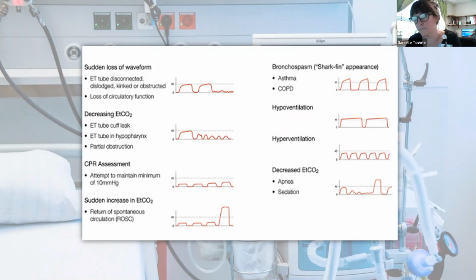So a normal end tidal is about 35 to 45 in a normal, healthy adult. Keep that in mind as I keep talking, okay? Higher than 45 usually indicates that there is retention occurring. And we end up increasing our minute ventilation by either increasing our tidal volume or increasing our respiratory rate, or maybe even both, right? Because like we talked about before, CO2, when you breathe more, you blow out more. So if our end tidal CO2 is high, we want to blow some of that off. We want to get it out of the body. The only way to blow it off is to blow more. And that's why we increase our tidal volume or our respiratory rate.